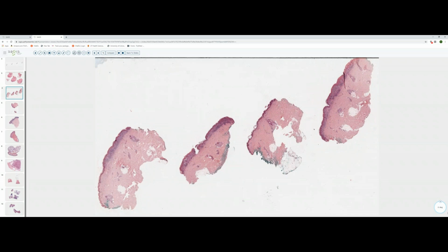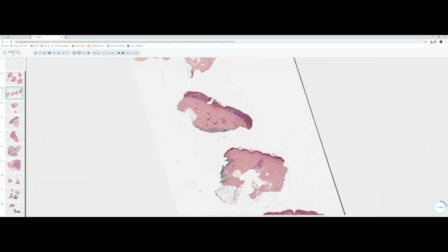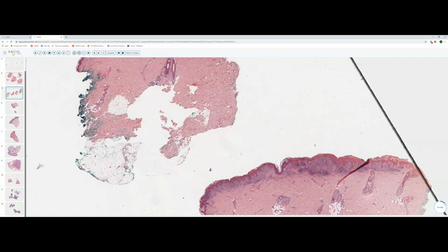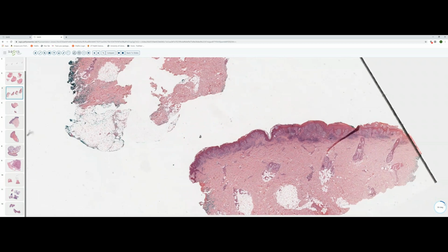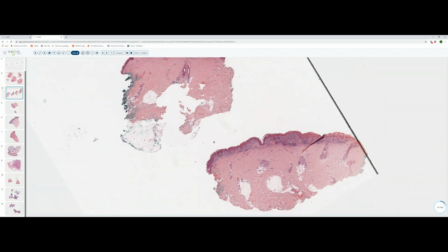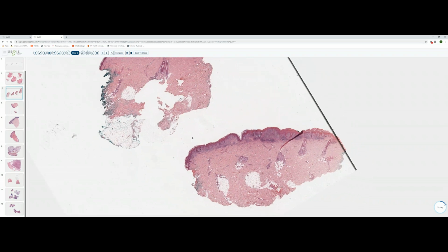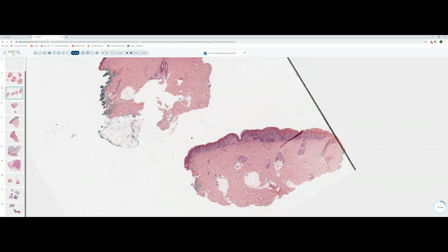Slide 4 was an incisional biopsy. And so if you looked at all pieces here, you could see that we had a partially sampled lesion. And clearly, I think even at scan, you can see that this lesion is characterized by nested aggregates of cells. This lesion is a little bit asymmetric with regards to the inflammatory infiltrate. So this inflammatory infiltrate in the dermis is a little more dense in one half of the specimen than the other.